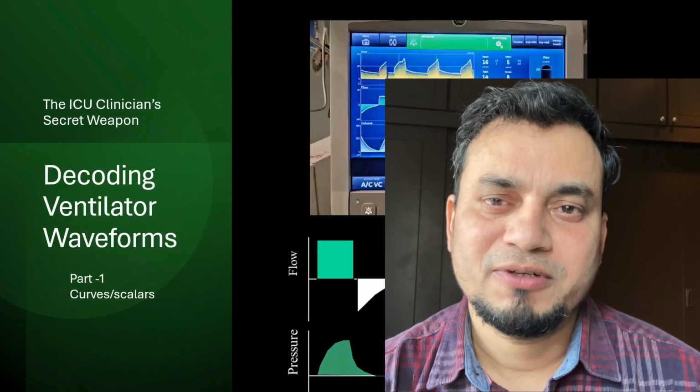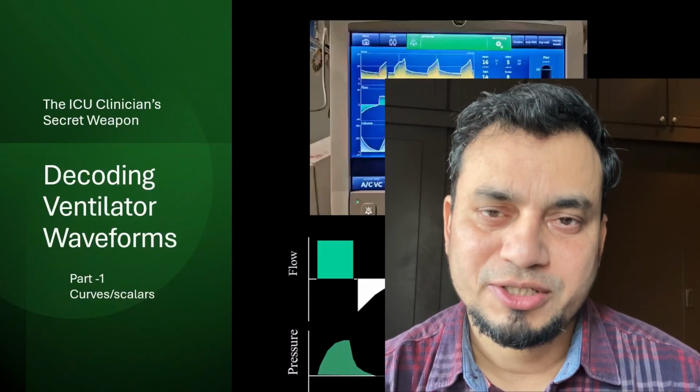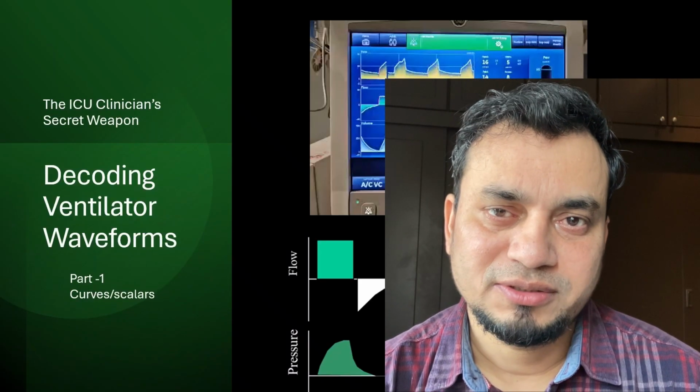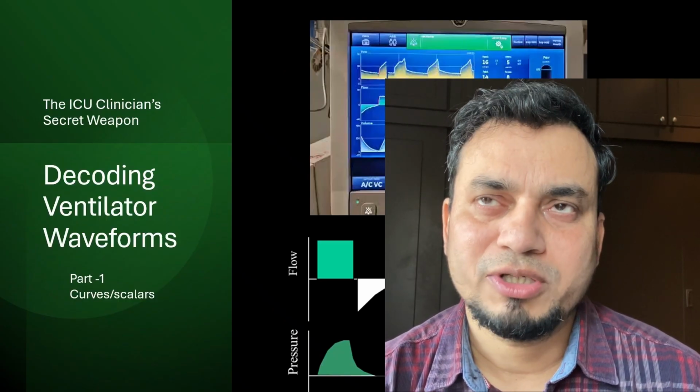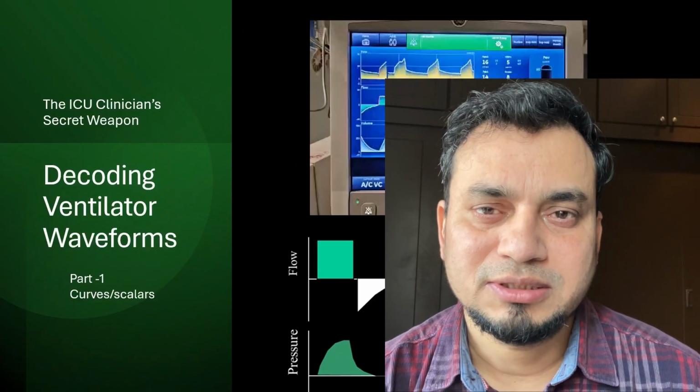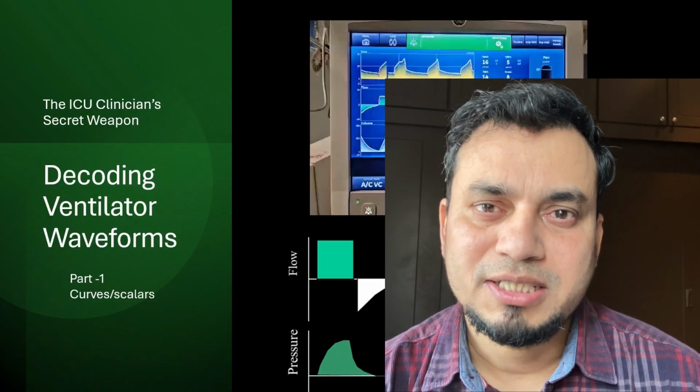Hi everybody, I have come up with one more lecture on ventilator graphics after the huge demand from my students. It's quite a huge topic, and this is the reason I have divided it into three videos.